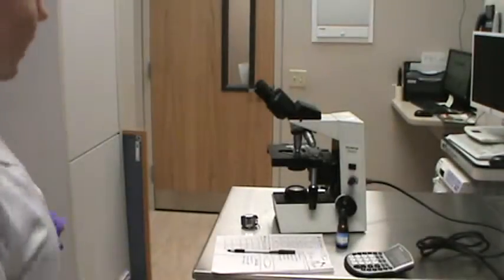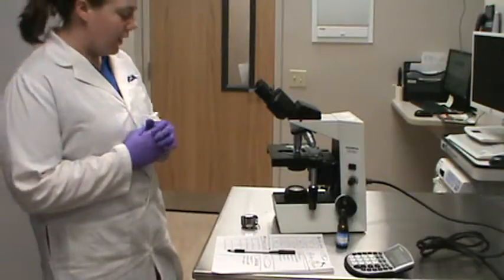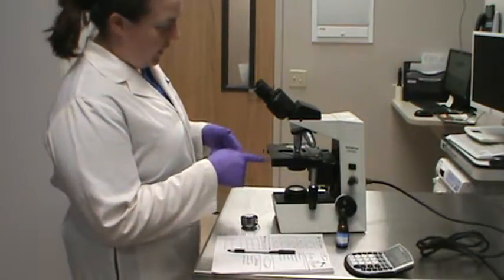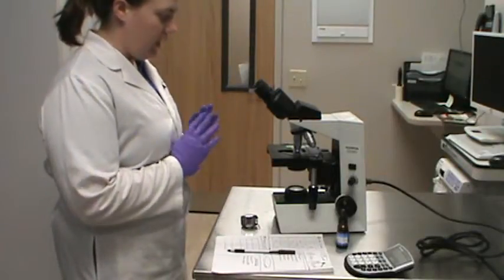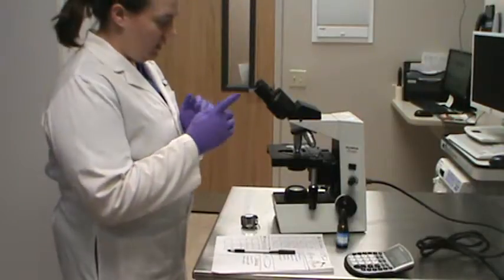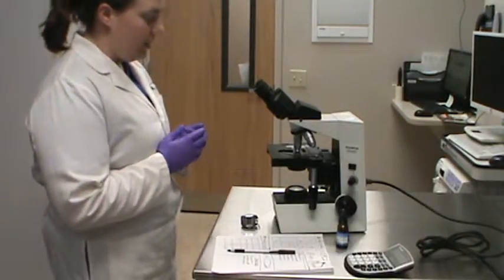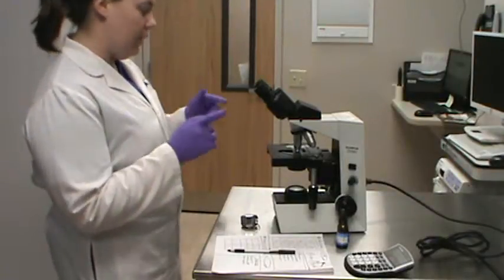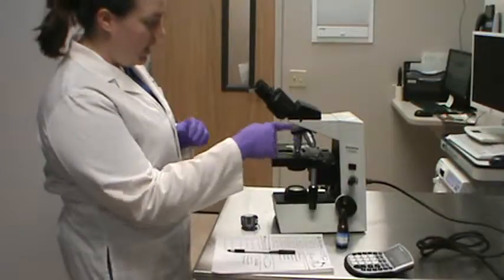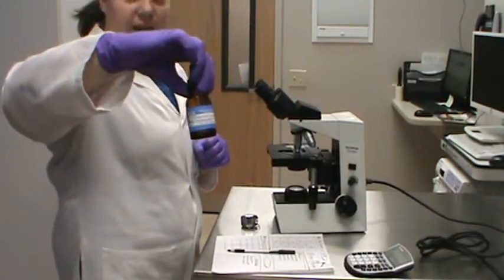Right, so continuing on with task 4, which is just performing a leukocyte differential. We still have our microscope, which still has the light on from when we just finished doing our white blood cell estimate. My slide is still on the 40 times objective lens. For the next step, we're going to move it over to the oil immersion lens, which is the 100 times lens. Right here I have my immersion oil in my secondary container.